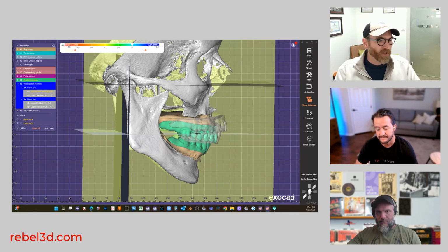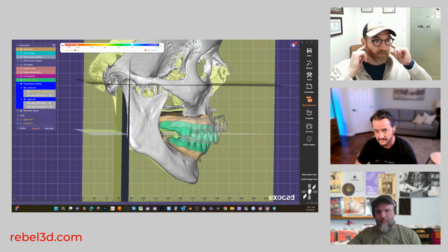It's okay, but I personally would go with some sort of leaf gauge, have them go forward, back, tap, tap, tap, and then squeeze a little bit, and make sure there's no pain. When they squeeze on that leaf gauge, make sure there's no intracapsular pain, like inflammation.